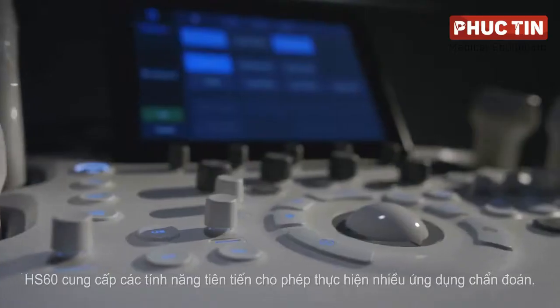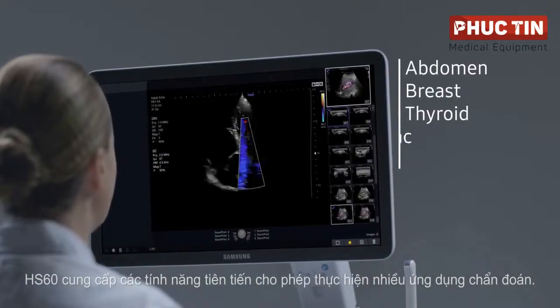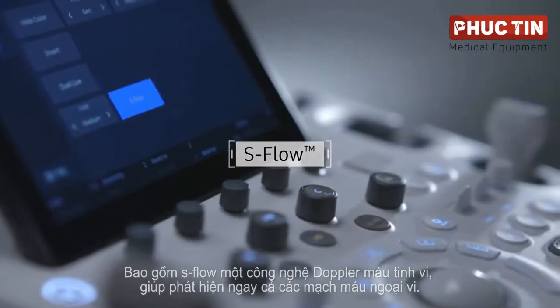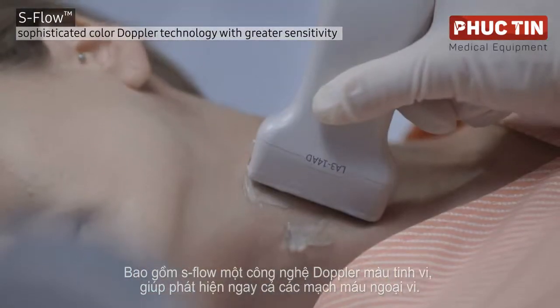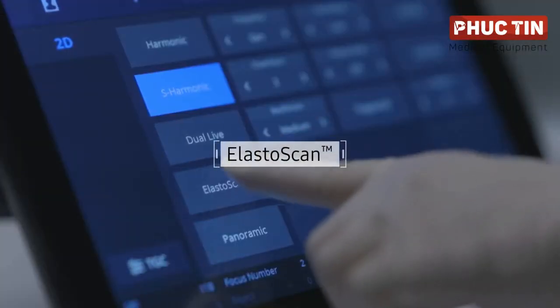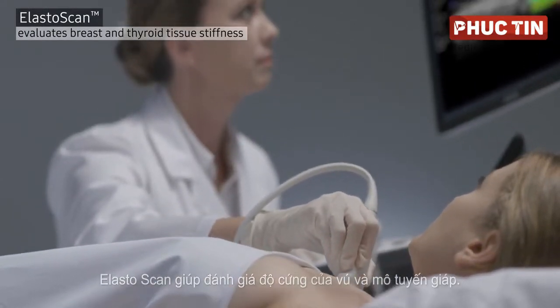The Hs60 provides advanced features that allow for a wide range of diagnostic applications, including S-Flow, a sophisticated color Doppler technology helping to detect even peripheral blood vessels, and Elastiscan, helping to evaluate breast and thyroid tissue stiffness.